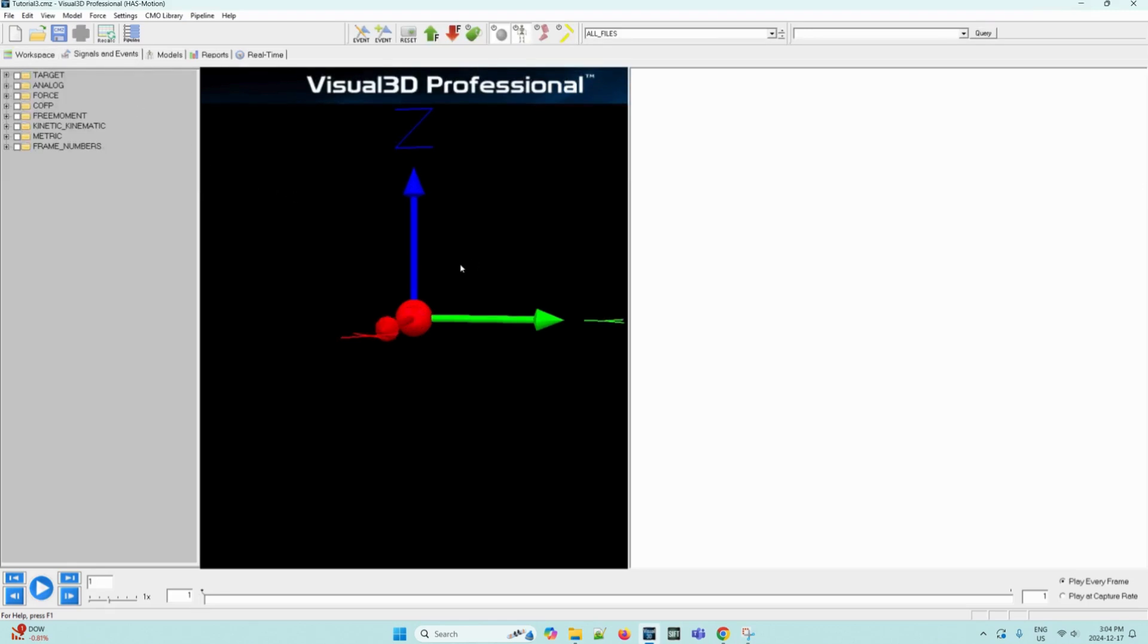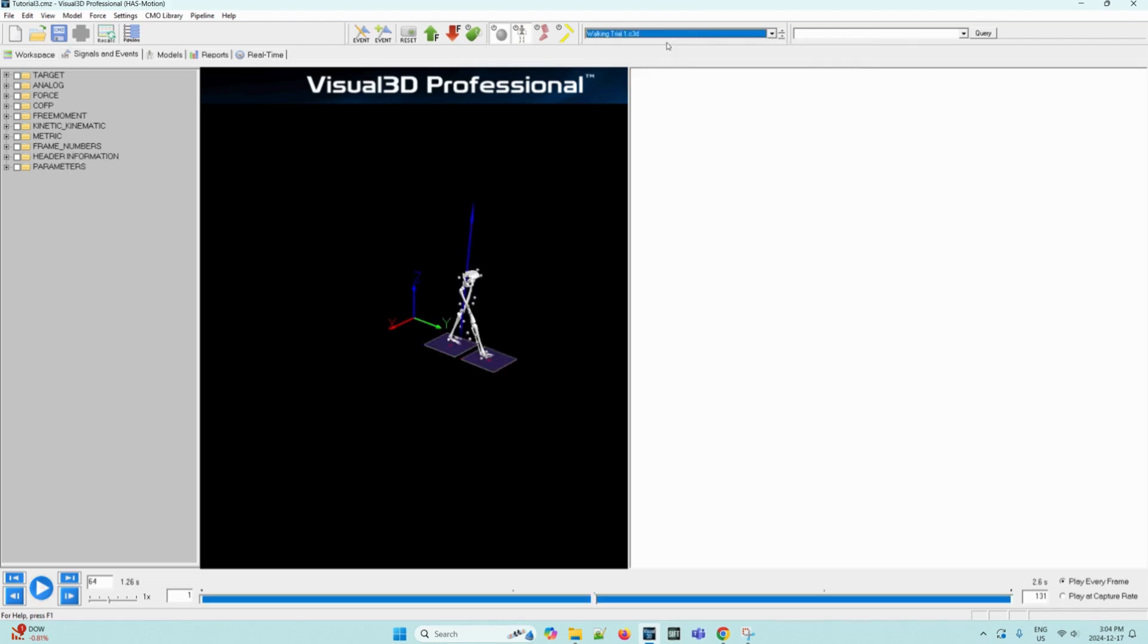If the animation doesn't appear in the 3D animation viewer, as we can't see it here, we have to check the combo box on the top right and make sure it says walking trial1.c3d rather than all files. Now that this has been loaded in, we can see that the model has appeared.